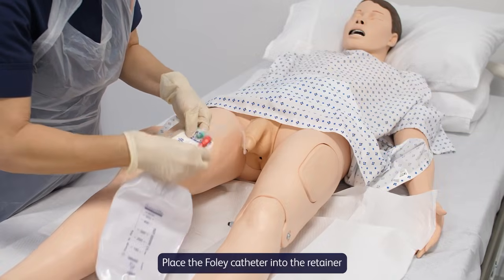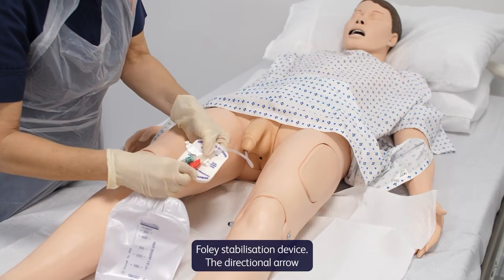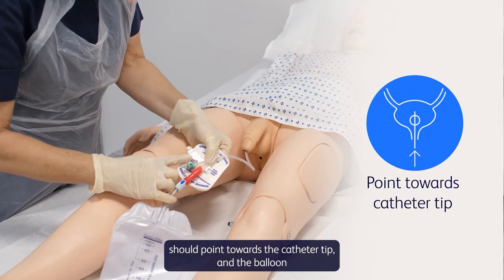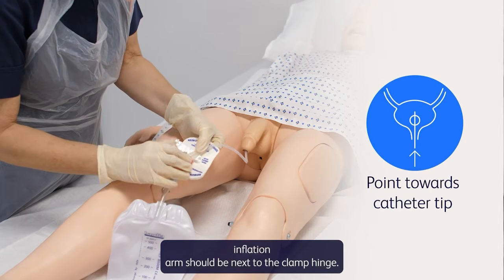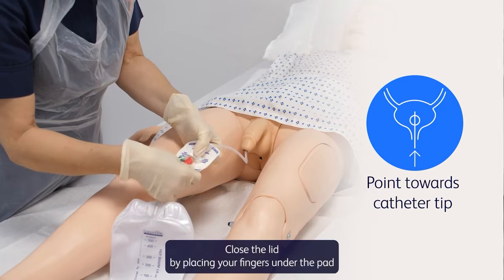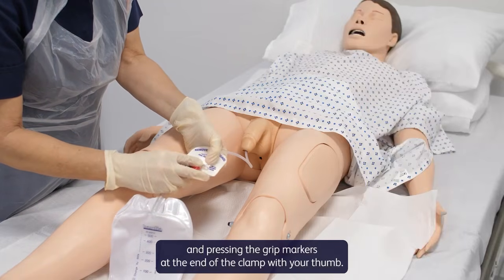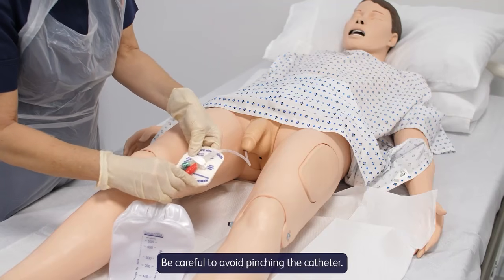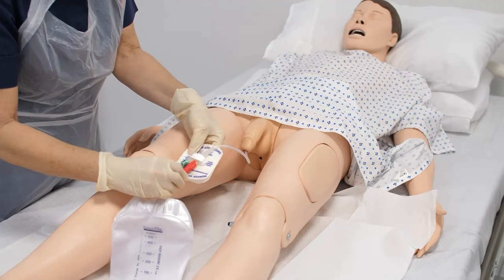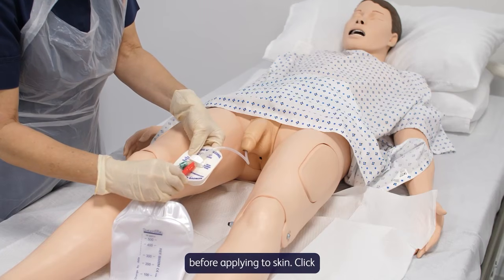Place the Foley catheter into the retainer on the StatLock Foley stabilization device. The directional arrow should point towards the catheter tip, and the balloon inflation arm should be next to the clamp hinge. Close the lid by placing your fingers under the pad and pressing the grip markers at the end of the clamp with your thumb. Be careful to avoid pinching the catheter. Always secure the catheter into the StatLock before applying to skin.